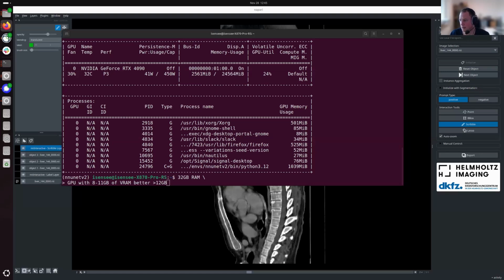So it's not necessarily integer. And even if it was, I don't think it would be good to stack this all into one channel for a convnet, because the convnet just interprets intensities and it would be really difficult to discern what the newest interaction is or what type of interaction I am even seeing. If you put the bounding boxes, scribbles and point prompts in the same channel, the network wouldn't be able to develop dedicated processing paths for the different interactions to optimally use them.